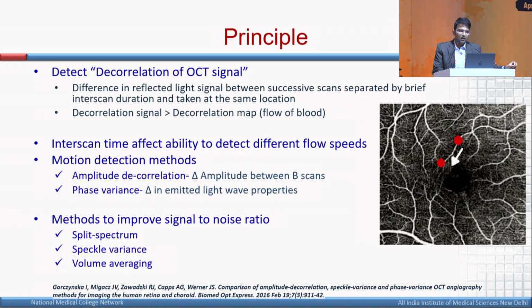Now, inter-scan time is very important in OCT angiography. You are taking successive B-scan images separated by a very short inter-scan time. If the blood flow is very rapid, the RBCs will move out of that B-scan image very quickly unless you have a very short inter-scan time. You need successive B-scan images to be taken while the RBC is moving from the first red dot to the second red dot, but the RBC should not move out of the B-scan image either. Otherwise, the flow will not be detected. So a very short inter-scan time is required for higher blood flows.